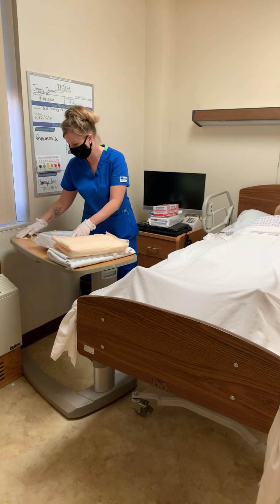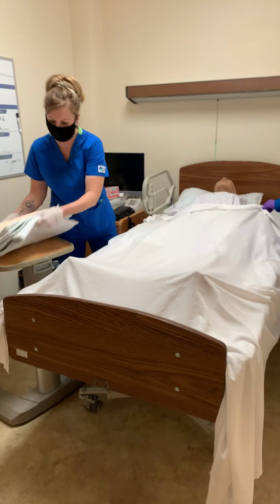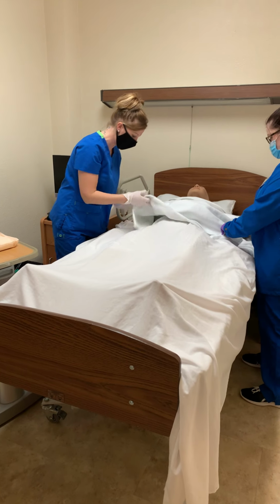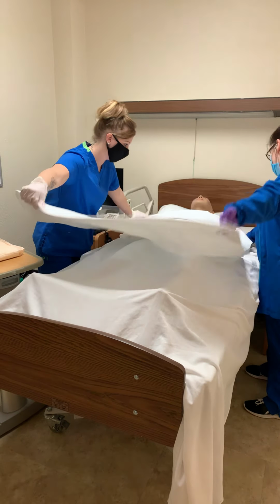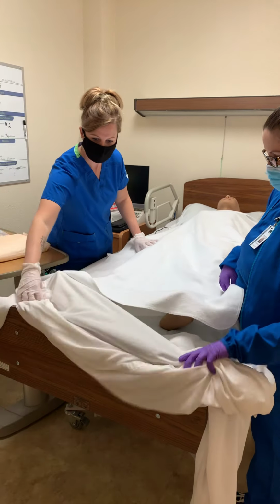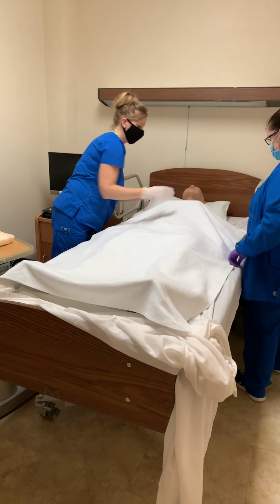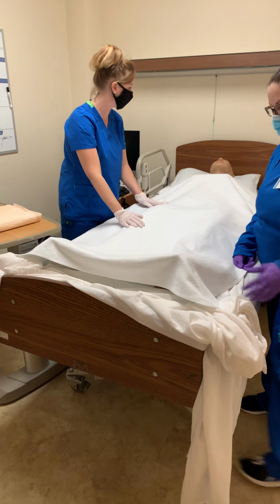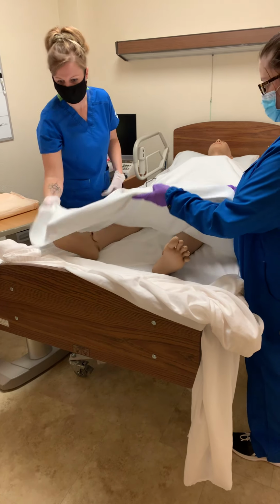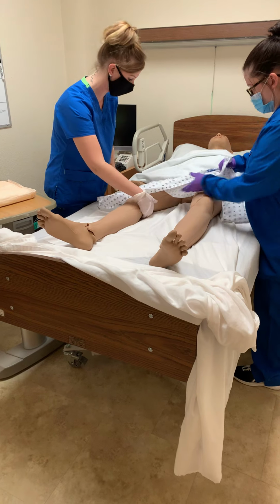Put that there. Okay. Now, Joanne, I'm going to put a bath blanket over you, and if I can have you hold the top, we're going to take your sheet down, okay? Okay. All right, thank you. Now, Joanne, I'm going to need you to go into what they call the frog position, where you're kind of spread eagle here, all right? We're going to put a barrier underneath your bum so your bedding doesn't get all wet.